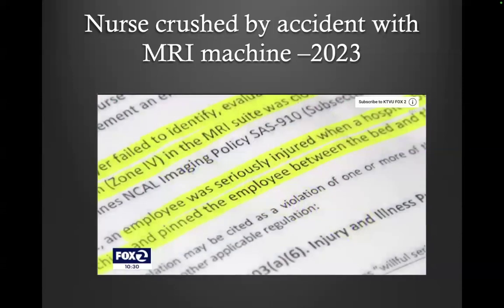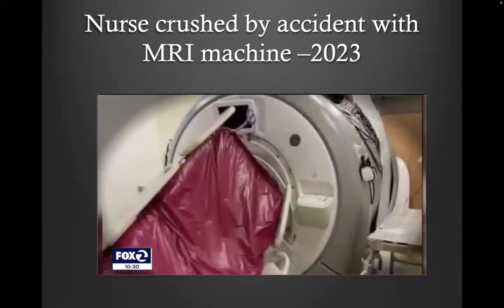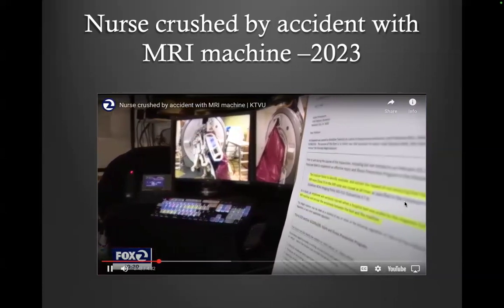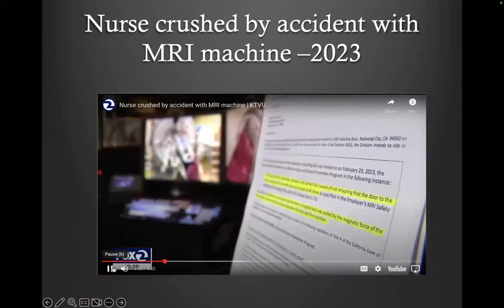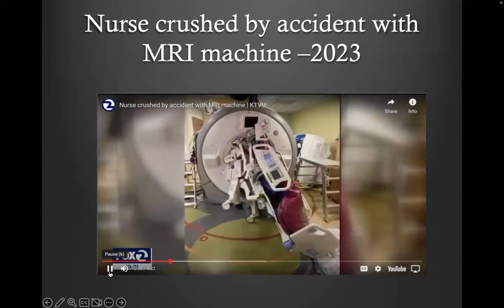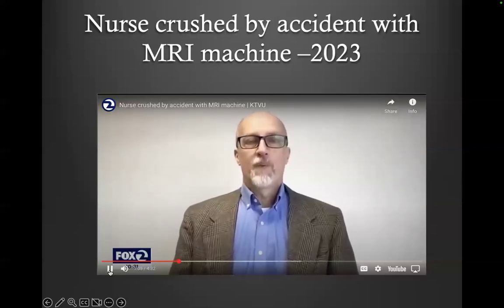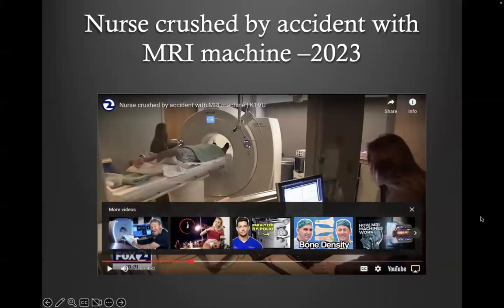A nurse became pinned between the bed and the machine, reports say. She suffered crushing injuries. The patient fell to the floor. The incident is detailed in a Cal OSHA investigation, concluding Kaiser failed to ensure the door to the MRI room remained closed and employees were following safety guidelines. The injured nurse recalling, "I was getting pushed by the bed. Basically, I was running backwards. If I didn't run, the bed would smash me underneath. My first thoughts were, not again."